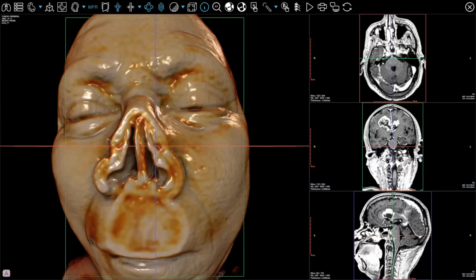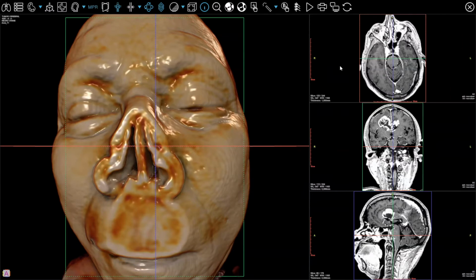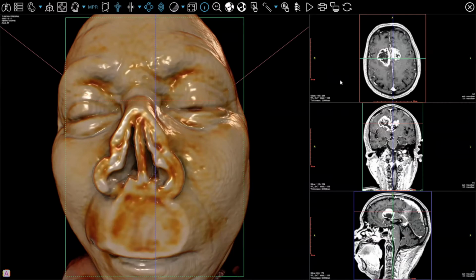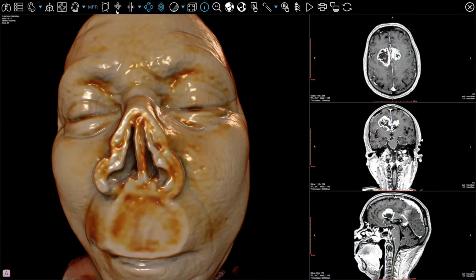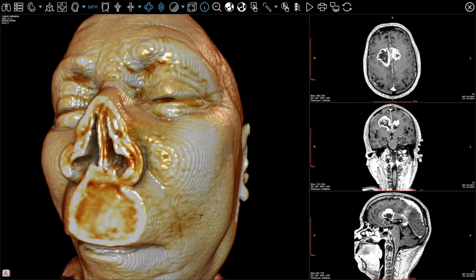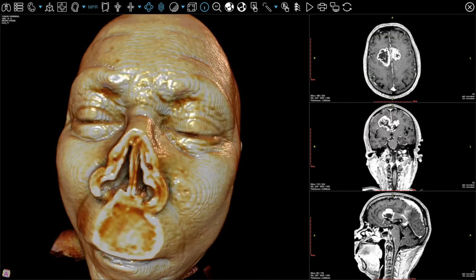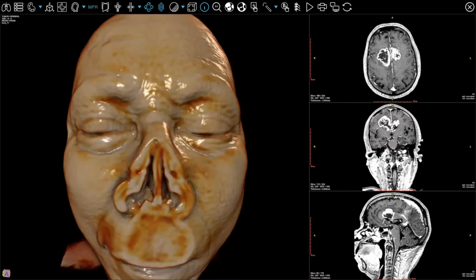All right. So if you focus on the Zoom meeting, you can see the webcam that Claudio is presenting. You can see himself as well. You can see that he's touching the anatomy table, and the initial position we have right now is a 3D reconstruction that our platform does. So we have the coronal and sagittal planes. We have all the planes on the right, as you can see. So basically, the platform imported DICOM information from the patient. And what you can see in the main part of the screen is a reconstruction that our platform did automatically.